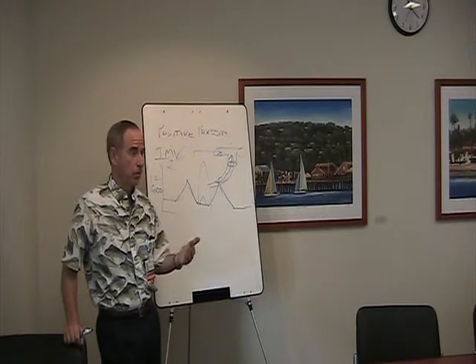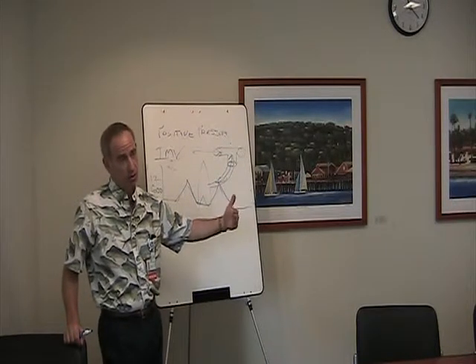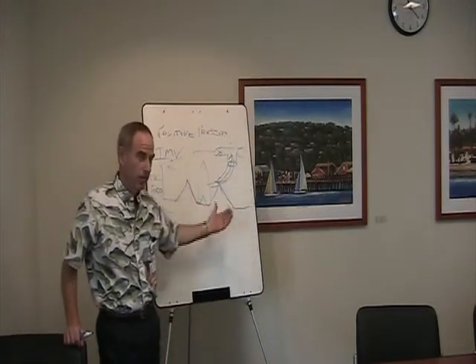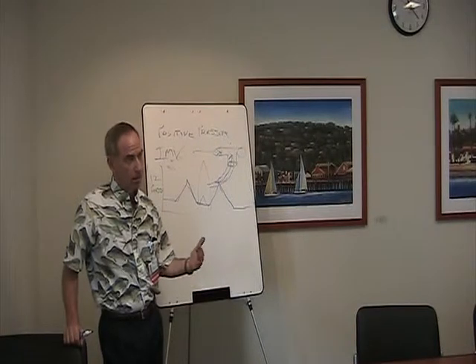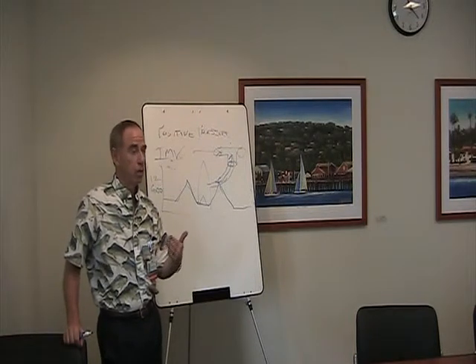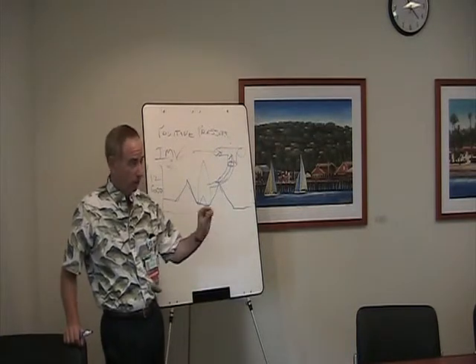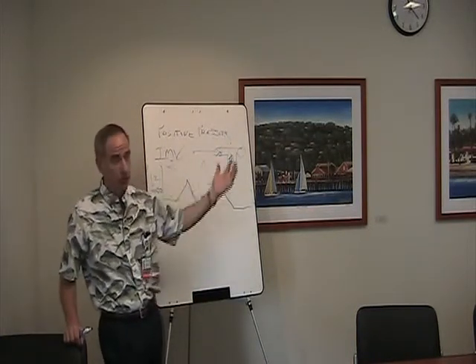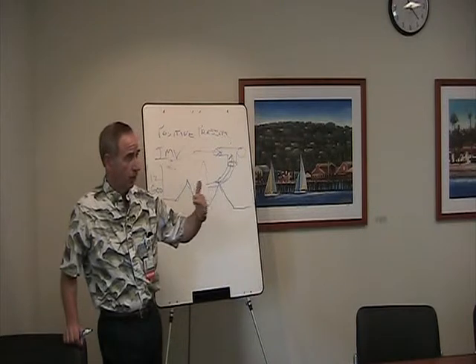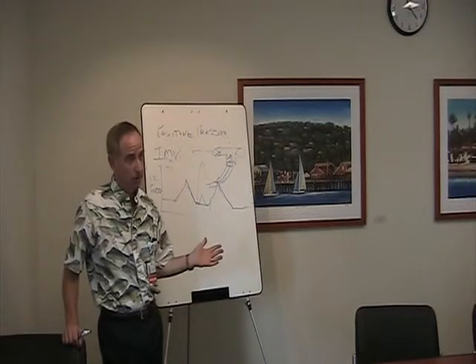Well, if you think about it, the rationale was that by doing these progressively longer T-piece trials, it would allow the patient to gradually build up the muscle strength to be liberated from the ventilator. That was the idea. But the problem was people were saying, yeah, but we're fully supporting them on assist control. They're doing almost no work of breathing on assist control, right? Because they're just initiating the breath, even if they're breathing on their own. A negative 1 or 2 centimeters of pressure will give them a full volume. They're not doing hardly any work. So they're going from doing almost no work on the ventilator to doing 100% of the work off the ventilator.